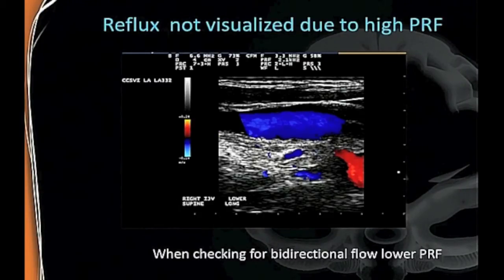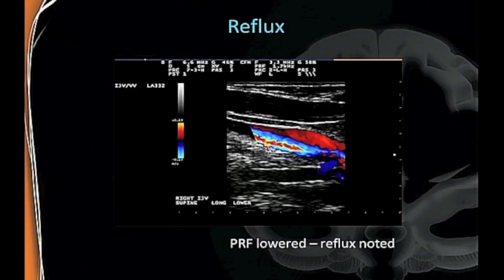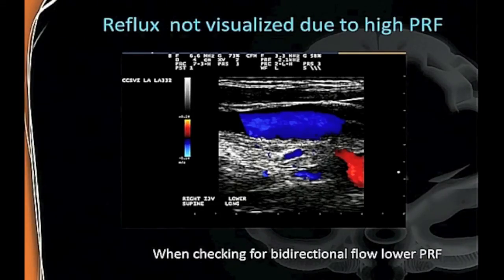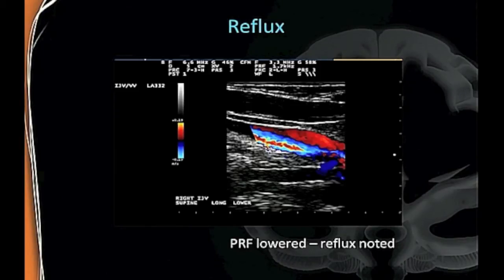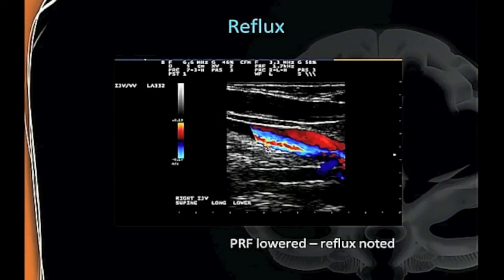This is a very important and commonly misunderstood factor. When looking for reflux or bidirectional flow, someone used to doing carotids might look at an image and say it's a lovely picture with nice flow. But if your PRF is way too high, you won't see the bidirectional flow—there's a black area where something's happening. When you lower your PRF and scale, you can actually see there's aliasing, which is the bidirectional flow. Your PRF is critically important in these studies, and your finger is almost constantly on it, adjusting to properly assess the flow.